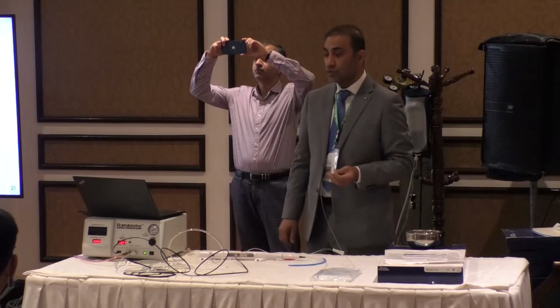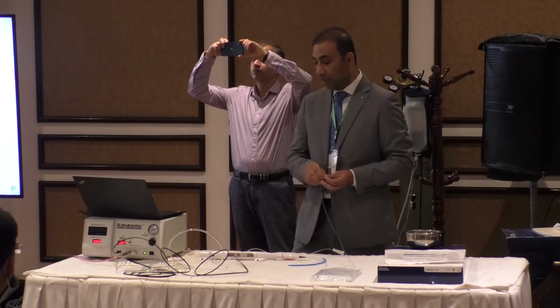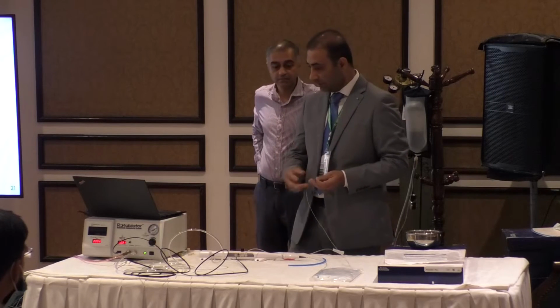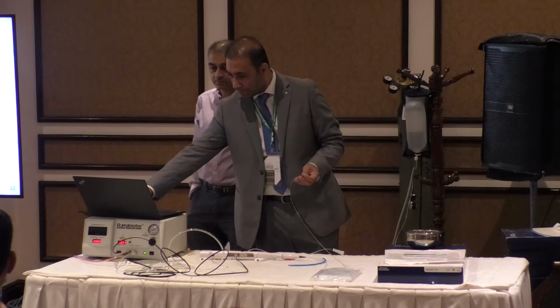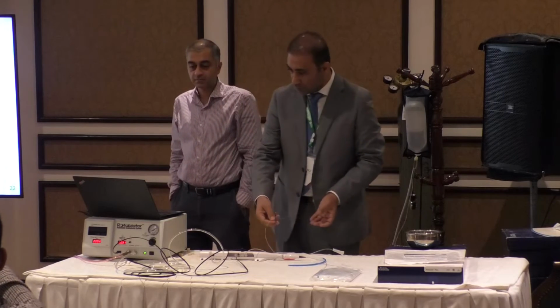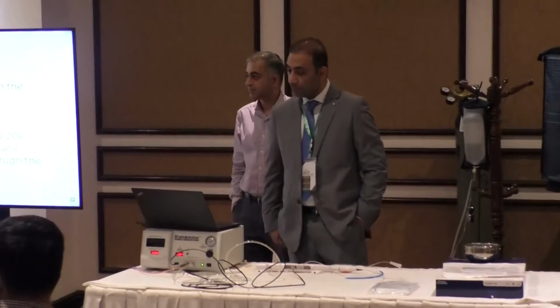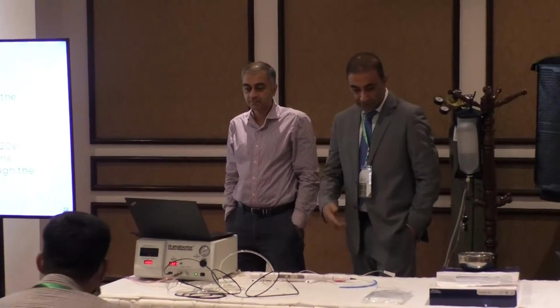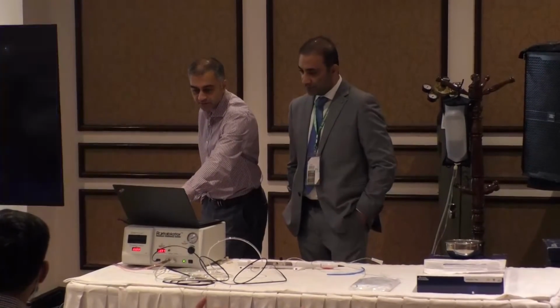And the fourth thing is you should look for your wire, that you have discharged out properly, and that you have also engaged it properly on the back of the advancer. So, any questions regarding the preparation of your inventory? We will definitely go through this practically.